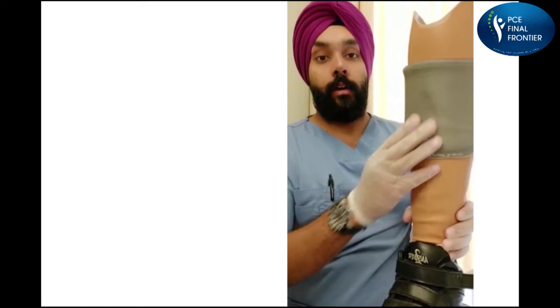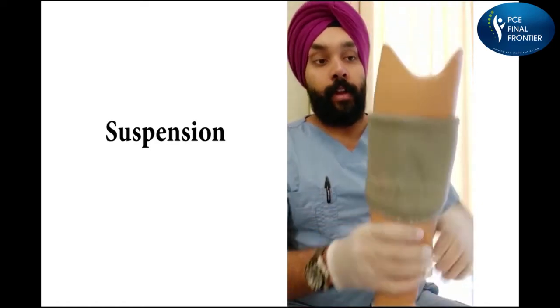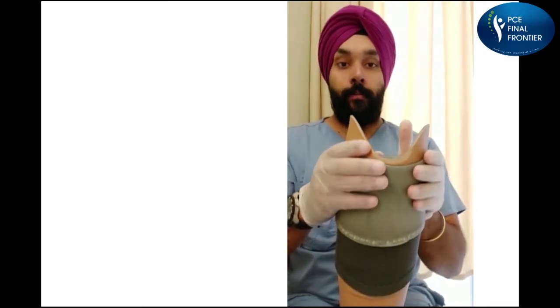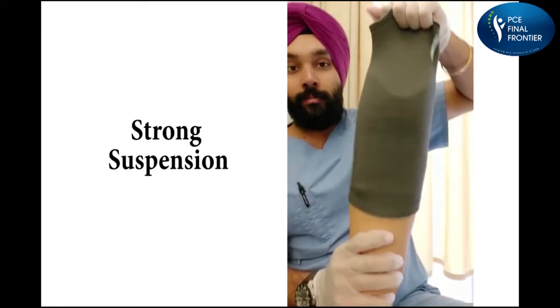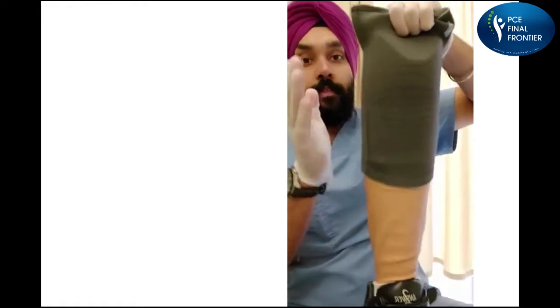Now you see, this is the suspension for this particular leg. When a patient inserts the leg inside the socket, what the patient does is pull this up and this gets stuck with the leg. So it does not allow the foot to slide down. You see, I'm trying to pull it, but it's not going down. Okay, there's only one way to take this suspension off, and that is that you have to roll it up there.